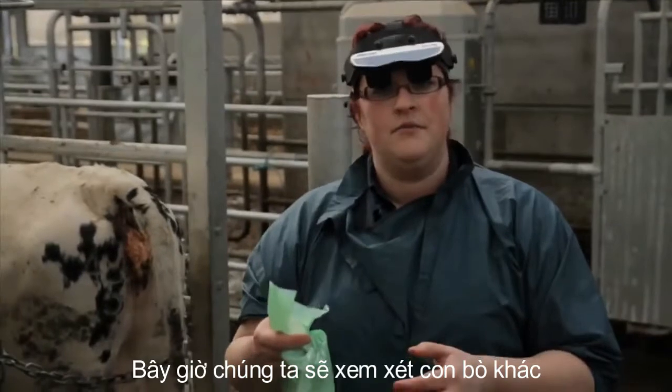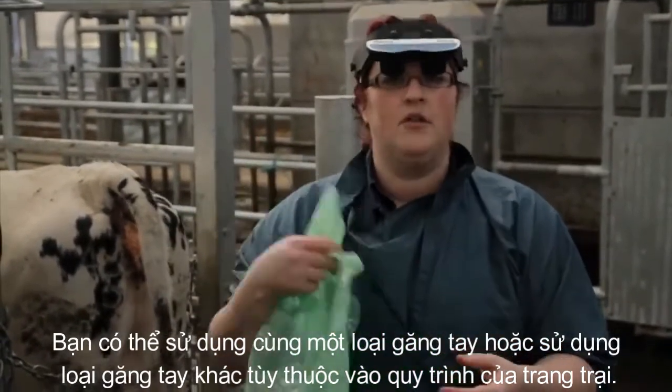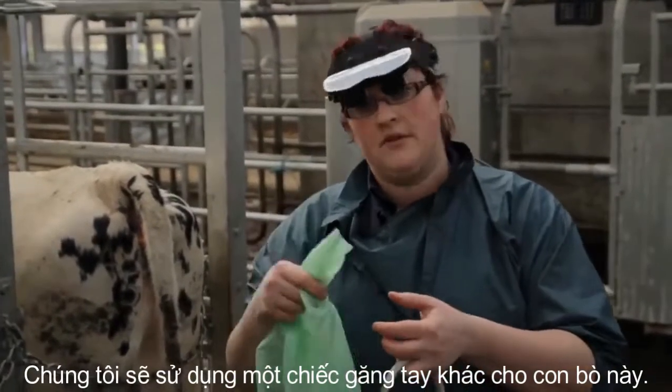Now we're going to look at another cow. You can either use the same glove or use a different glove depending on the protocols on the farm. We'll use a different glove for this cow.